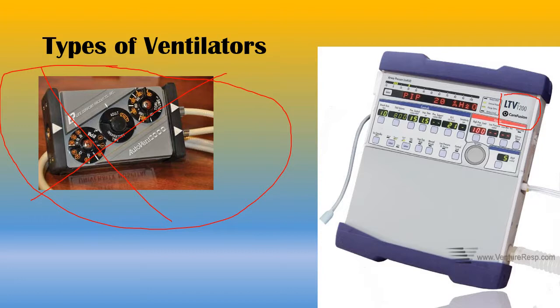So we shouldn't be using simple ventilators like this anymore. We want ventilators that do stuff like PEEP and FiO2, all that stuff we're going to learn about later. You want that stuff for your patient. This doesn't do any of that. So you want a good ventilator for your service.